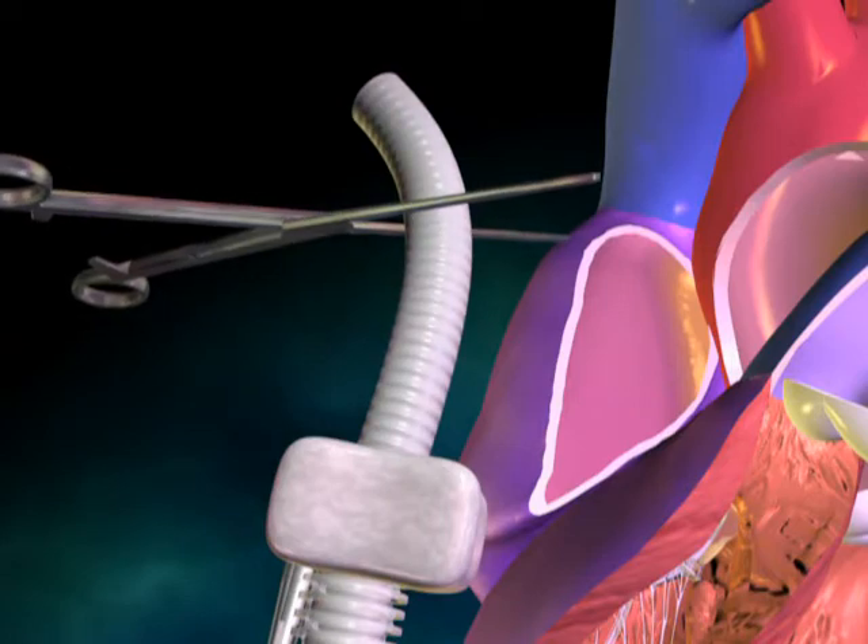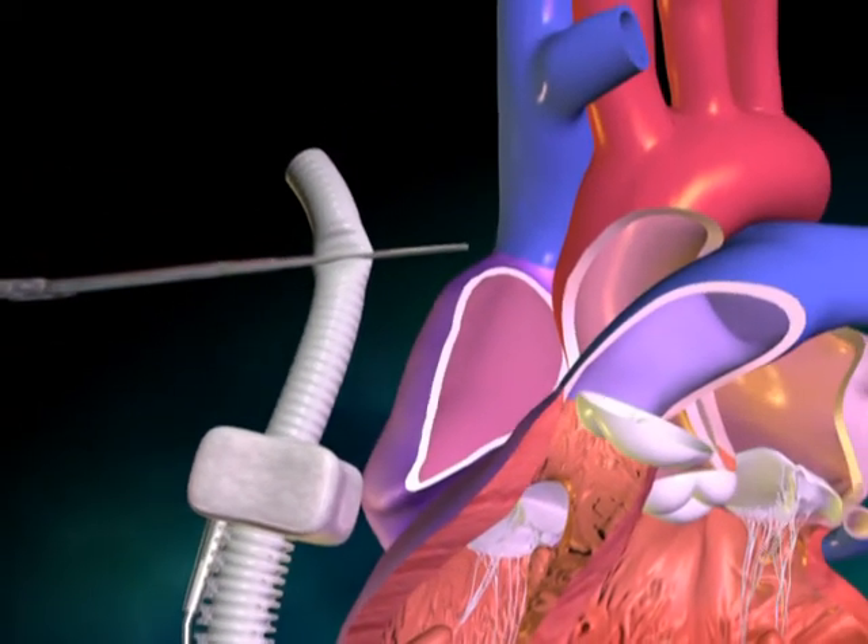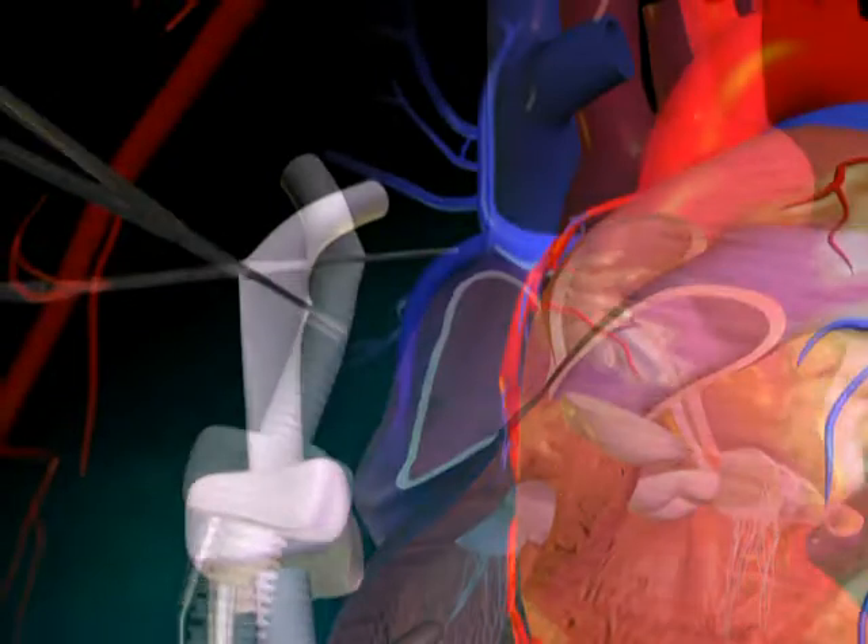Then, by releasing the clamp, de-air the pump and graft. Replace the clamp on the outflow graft.